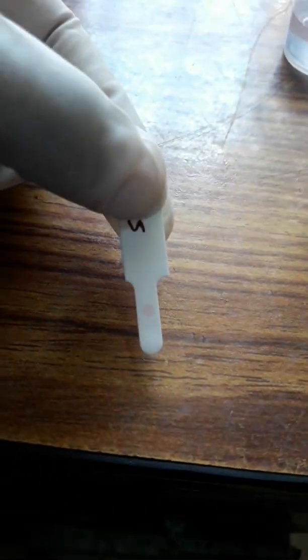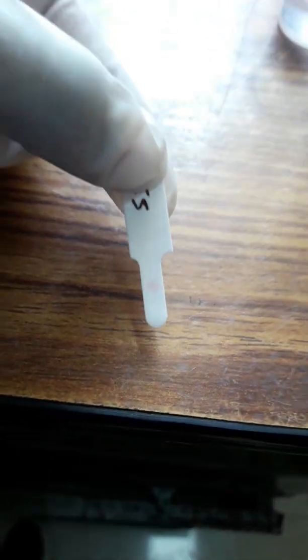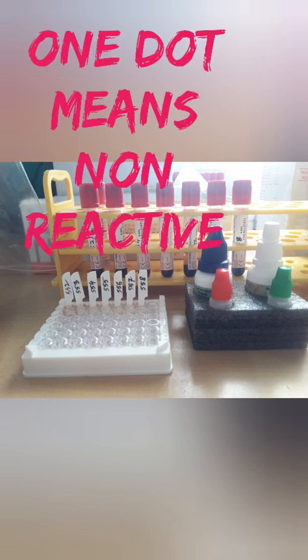Now finally we can see the result. One dot means non-reactive, which means negative. If there are two dots, that means positive. Our result is non-reactive, meaning negative.